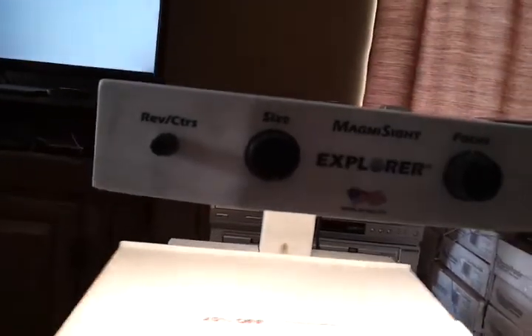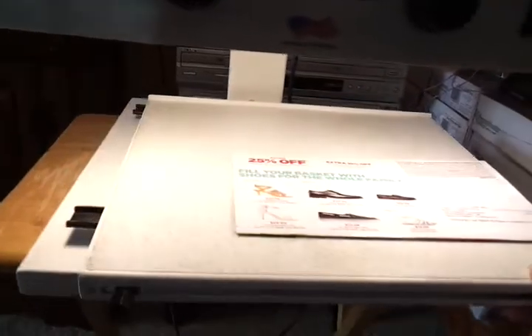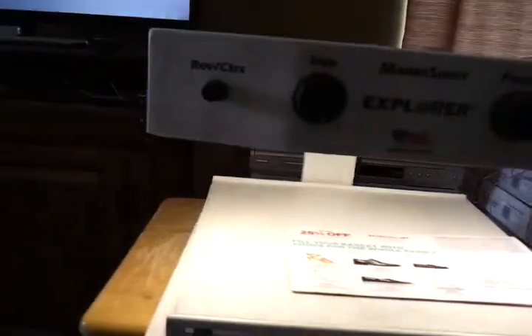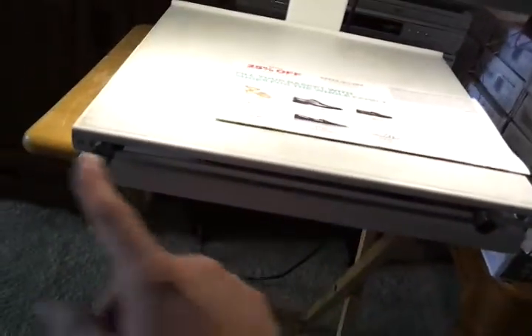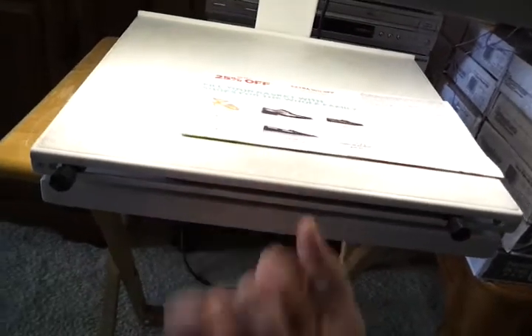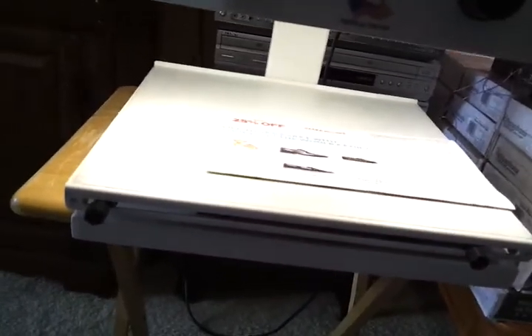It's got basically an X and Y axis, and you can move both of them at the same time. You can clamp them in place with these knobs on the side — there's one knob here you clamp shut, and then these two knobs in the middle you clamp together to make it stay put.